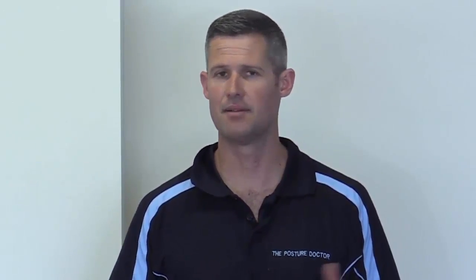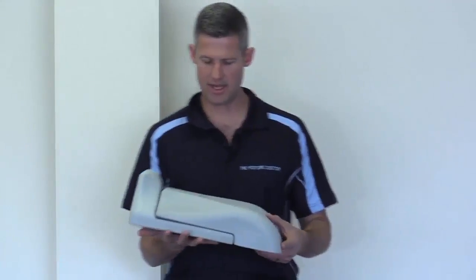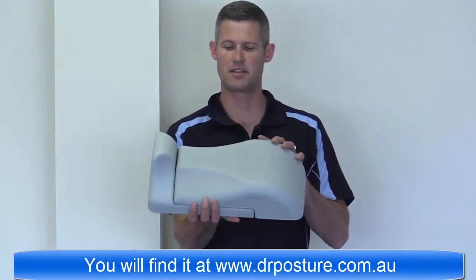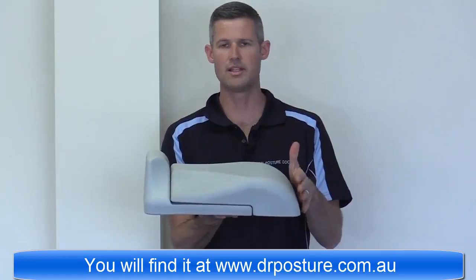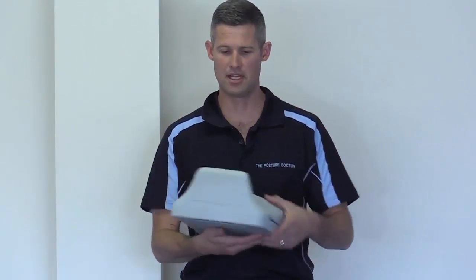This is the most common postural problem and is associated with low back pain, middle back pain, headaches, fatigue, lots of aches and pains. So if you've got this posture and you're watching this video, I've prescribed this exercise to you. This is a thoracic lift. It's a foam block which will take your thorax and shift it forward. I will demonstrate that for you in just a moment.